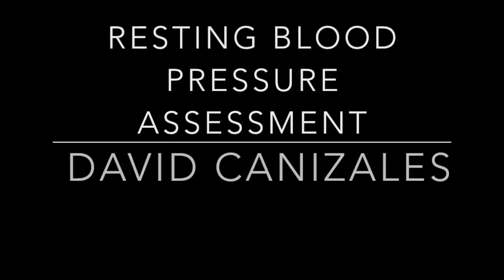Prior to measuring blood pressure, the subject must remain sitting for at least 5 minutes and refrain from smoking cigarettes and consuming caffeine at least 30 minutes before the assessment. Measurements must be taken on the bare arm.